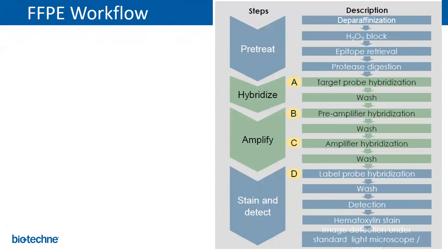I guess my question really is, do you get an artificially high signal for count? So if you're looking at a specific target, your RNA breaks, you take a big RNA and probe it, you see 3 smaller dots, and accidentally count 3 instead of 1. Yeah. The question is, if your RNA is fragmented, do you get artificially high signal? No, because we need at least 6 to bind before we even see a dot at all. And so if you don't have at least 6 pairs, you're not going to see a dot. And again, the probe is designed against a specific sequence. So we only have 1,000 base pairs to work with. So in that space, the RNA shouldn't be too much fragmented and moving around the tissue.